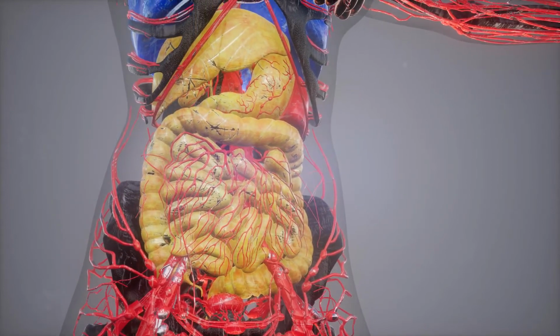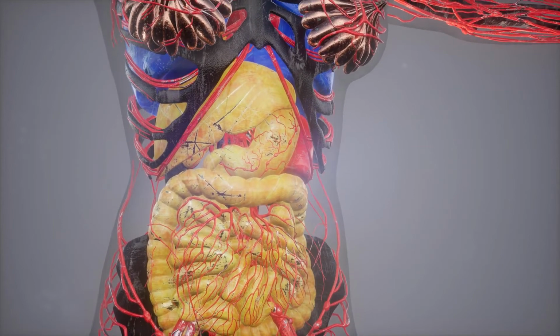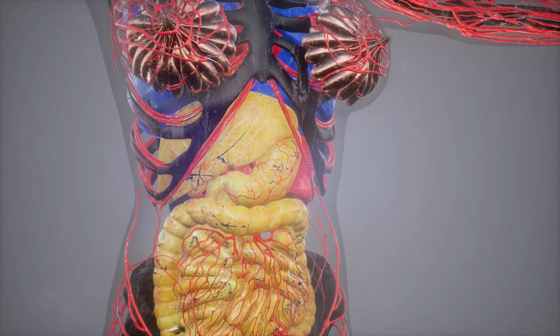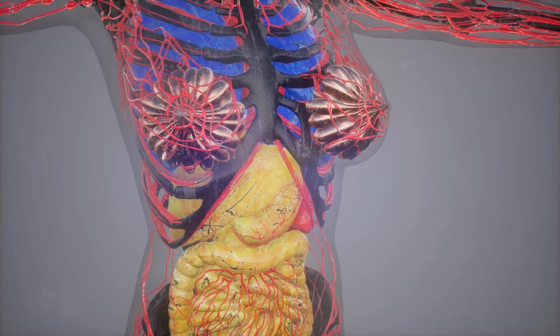During the test, the doctor may also use the scope to extract a foreign object from the lungs or drain abscesses. In some cases, a bronchoscopy can be performed as a way to treat lung cancer.